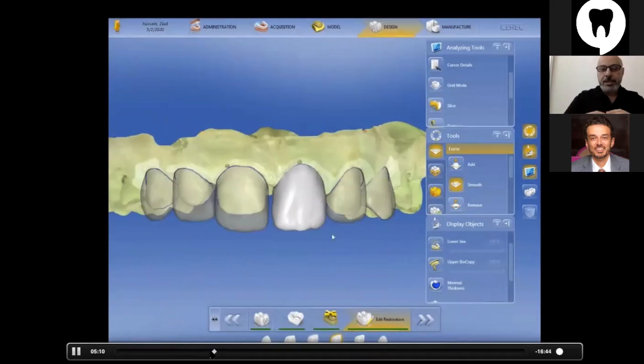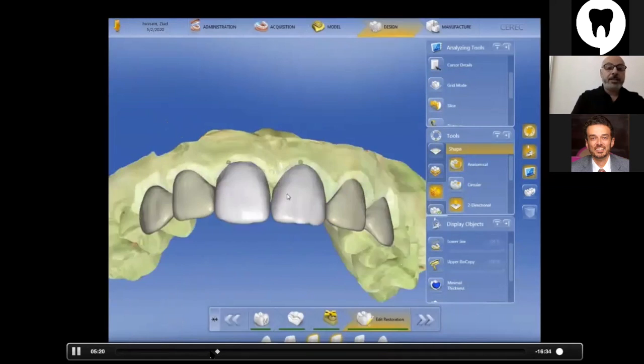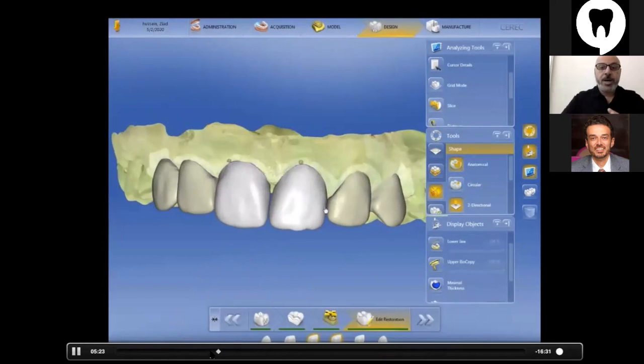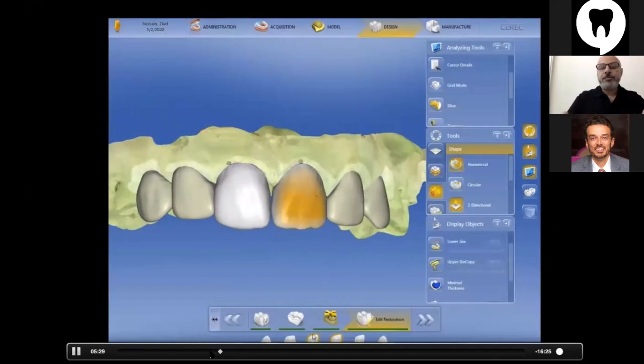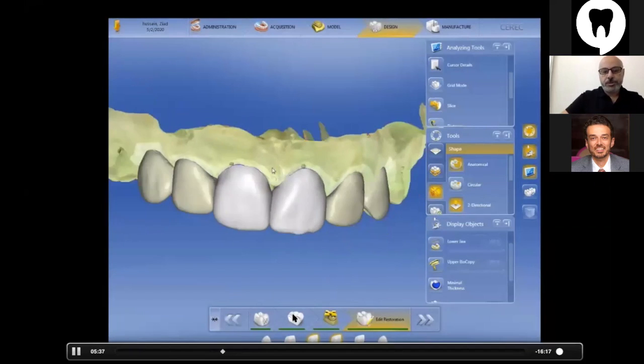You have to see them actually step by step from the gingiva to the incisal edge. It's not just a quick view. It's very important to mimic both sides together, and that's why you have to look at them from the incisal view, from the profile, lateral view, right and left, and of course the labial view, which you'll always use for adjusting the final contours.